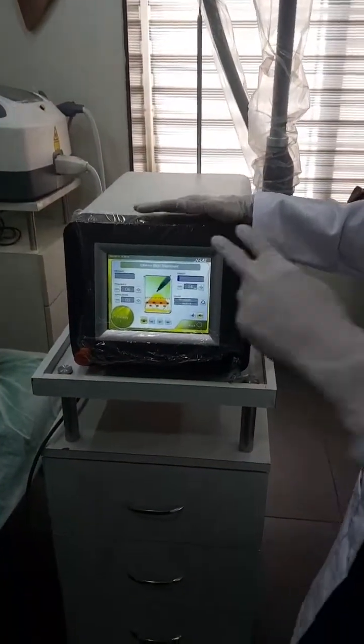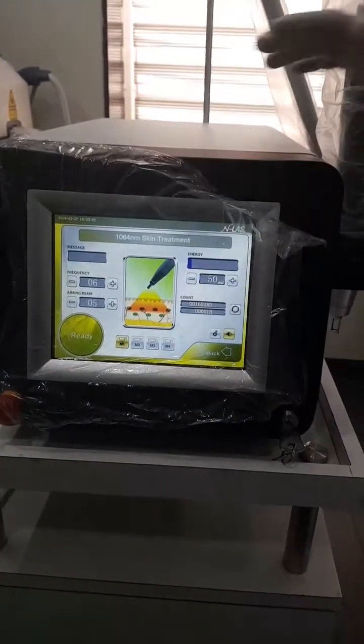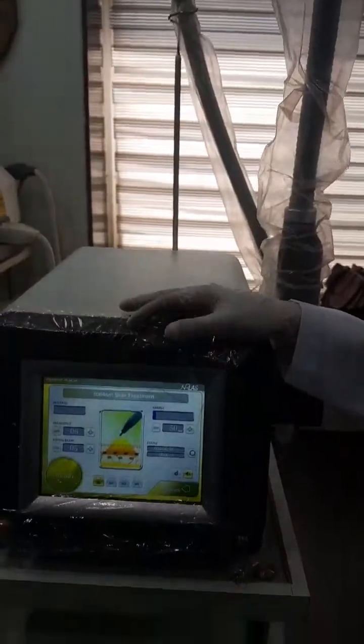So this is the machine — can you just focus on the machine? This machine we use to remove the tattoo. First of all, let me explain what procedure we are going to do today. We also use it for removal of birthmarks.